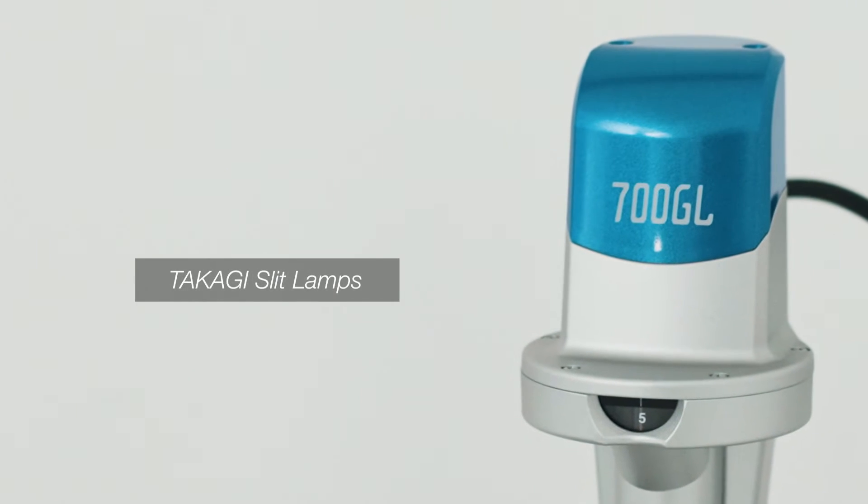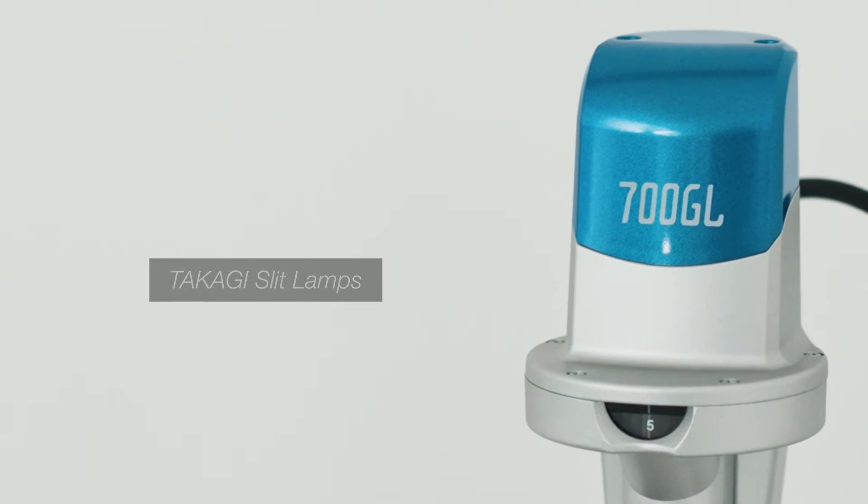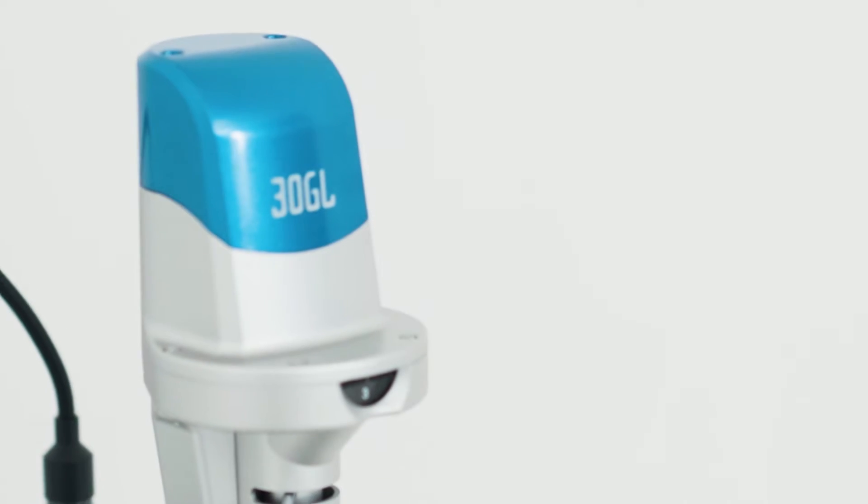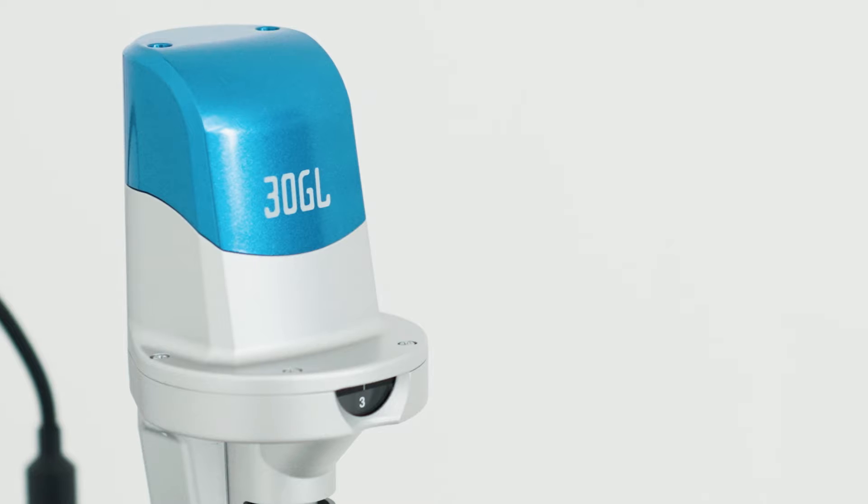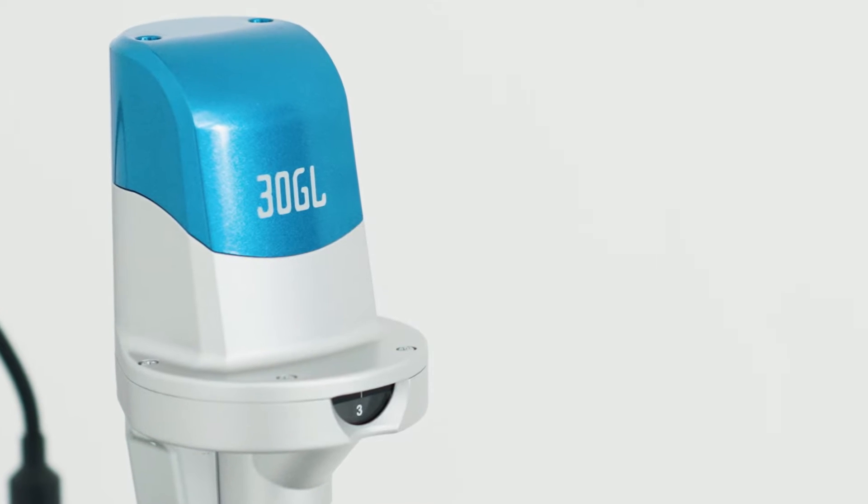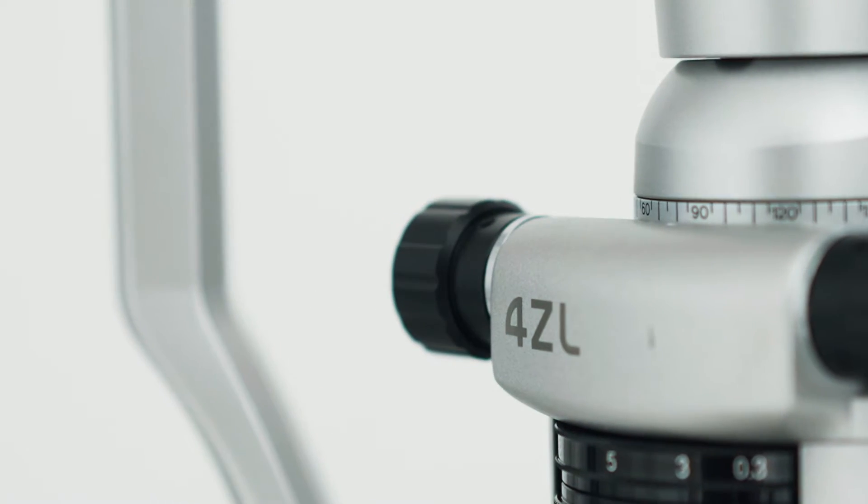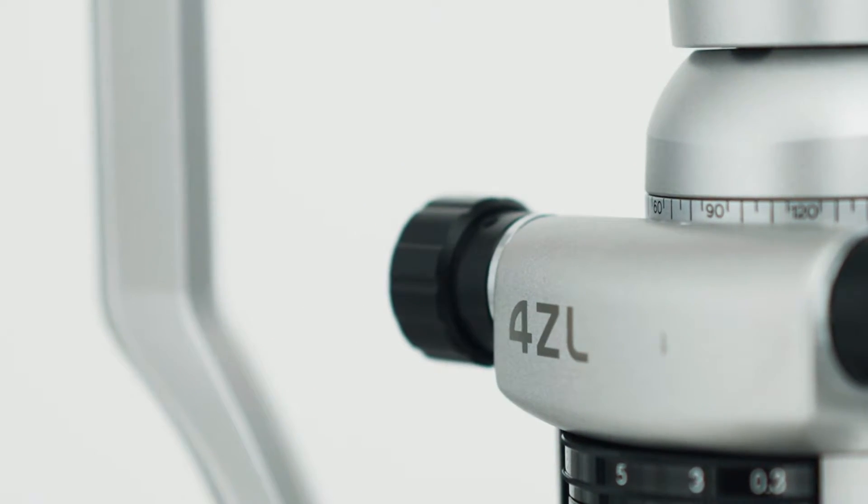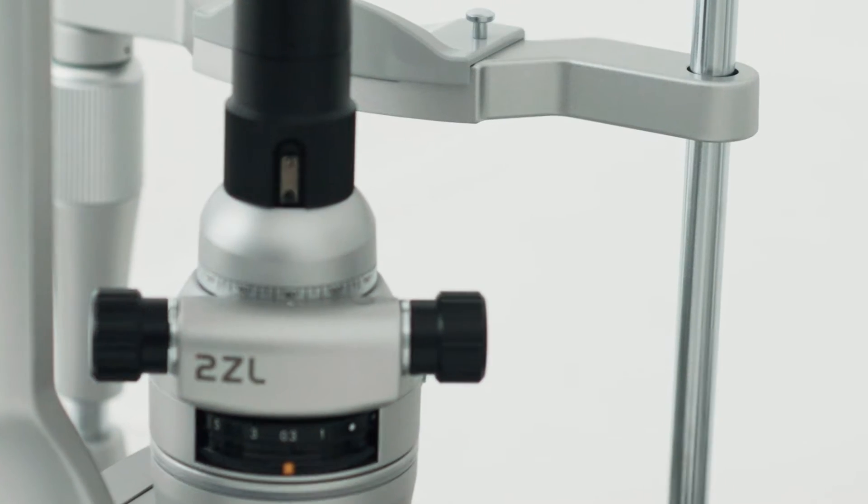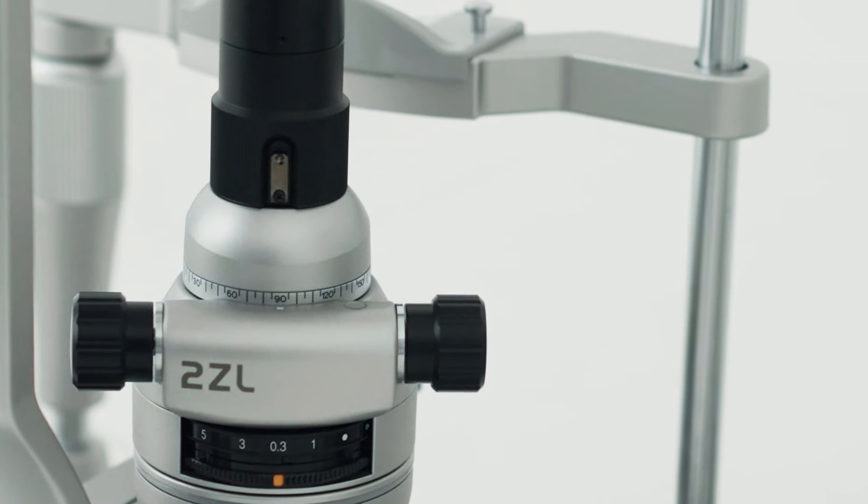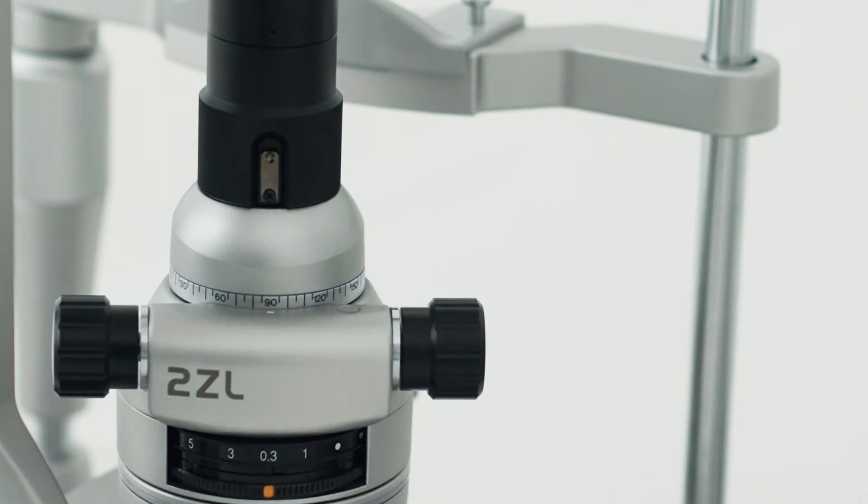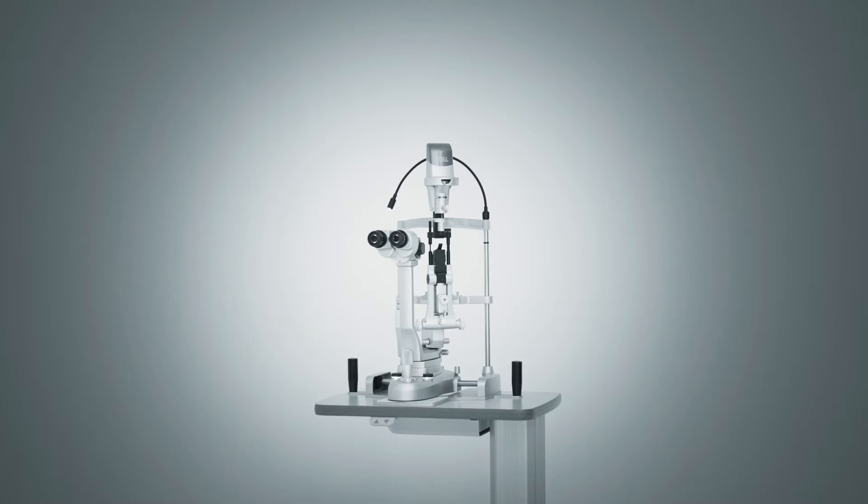Takagi's slit lamps feature globally recognized technologies that are essential for high-quality eye care, including outstanding light source characteristics and reliable optics.